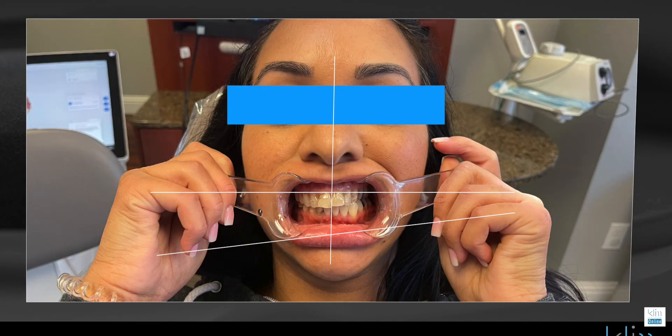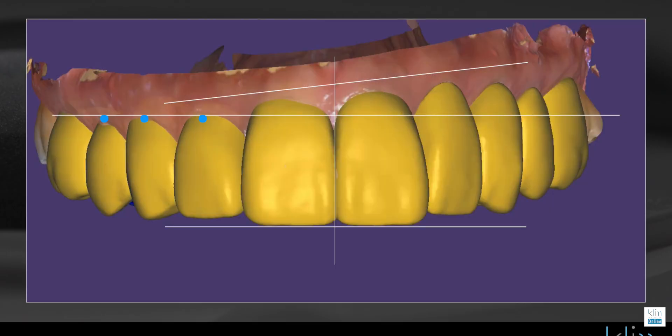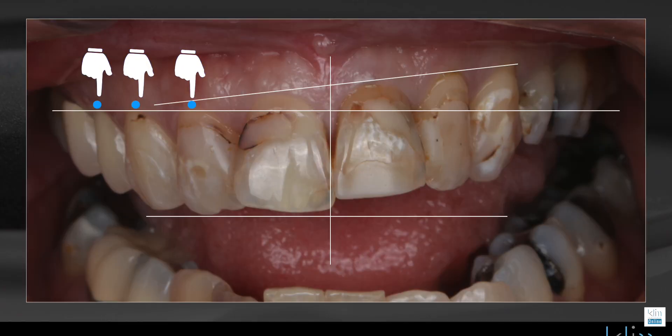One thing that really helps me — even when I'm not using the smile feature, which is about two thirds of the time — I still take a retracted view of the patient. Why is that important? Because with that I can see the axis of the face and identify any cant I want to change. On that picture I'll identify several points in the mouth, whether it be soft tissue line or the edge of a tooth, to set up my axis.